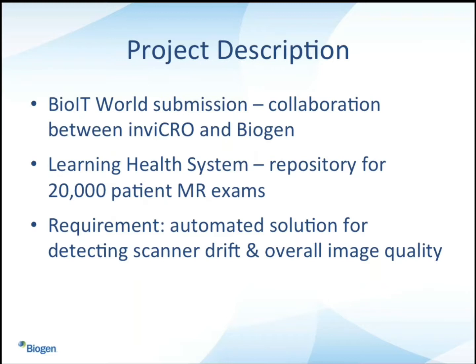The data types we intend to collect in the learning healthcare system range from imaging data, MR imaging data, clinical data from their EMR systems, and standardized biosample collections, so blood samples, and downstream analysis of those blood samples. So the learning health system will ultimately be a repository for about 20,000 patient MRI data sets at the end of next year.